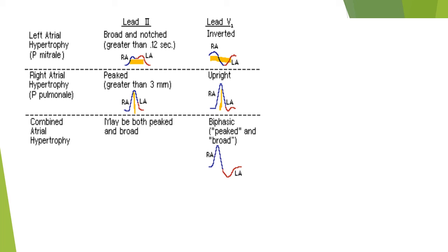Sometimes there is biatrial dilatation, and there is a combination of both of these.